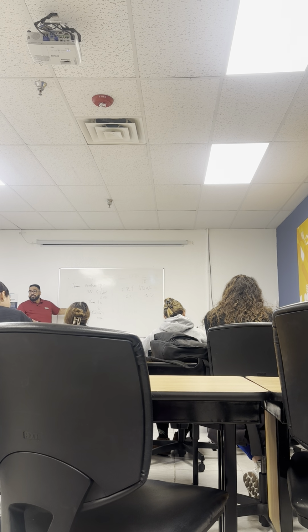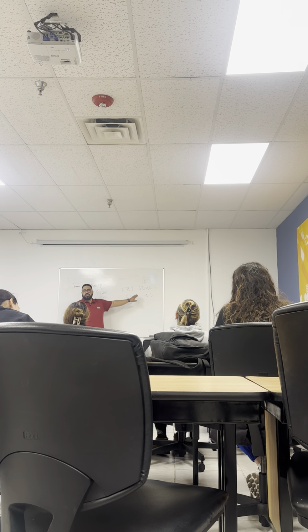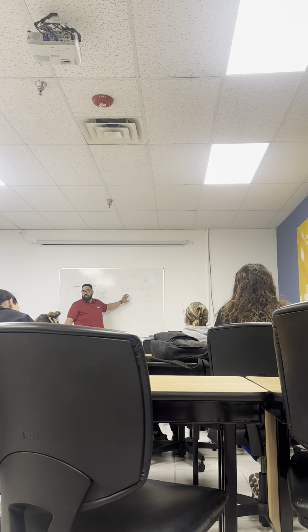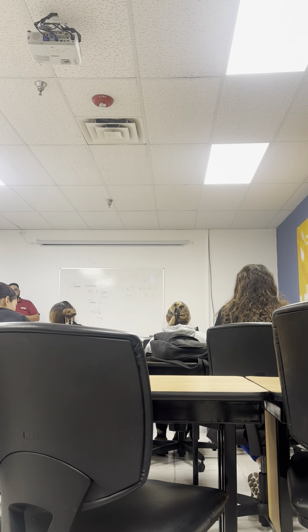I didn't give you the distance, but we know through reasoning that if we halve the distance, we do the opposite to the frame rate, which is multiply times 2. So that's how we get 20 hertz. 10 hertz times 2 is 20. Okay. Got it.